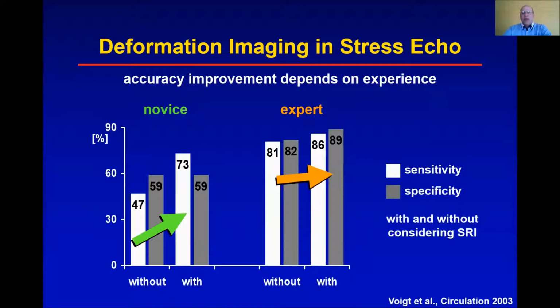Every now and then it will help you to make your decision, but who gains the most are the inexperienced young people. What you can see here on the left side is a novice reader who is more or less tossing a coin when making a report. This novice reader will improve his sensitivity without losing specificity by using this technique.